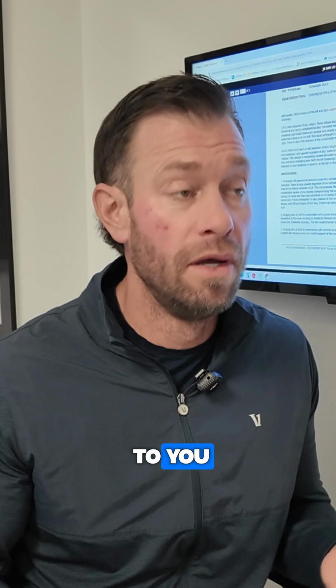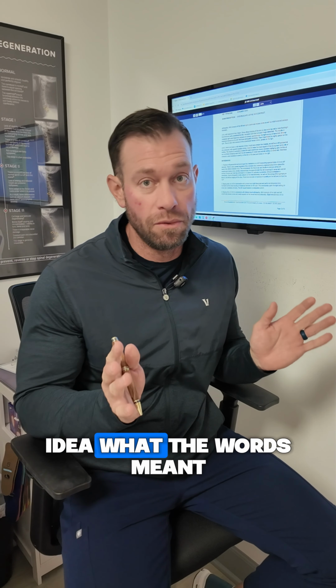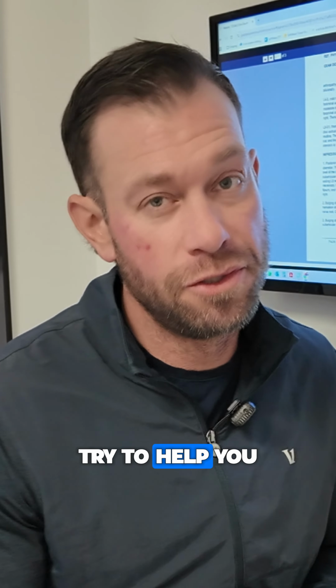Have you ever had an MRI and the doctor really just didn't explain it to you, or you got the report and you had no idea what the words meant? Well, this video is going to try to help you out a little bit.